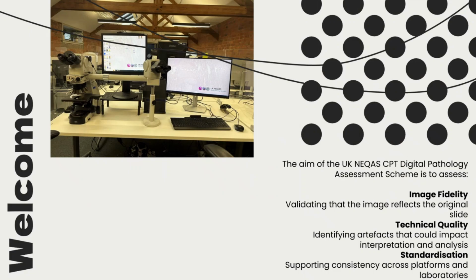The aim of the digital pathology quality assessment scheme is to assess the quality of the digitisation of a glass slide. So if you are familiar with who we are, you know we've assessed glass for years. As it was alluded to when Joe mentioned it, there's been so many glass schemes for so many years. But with the advent of digital pathology, we need to provide a scheme that assesses the quality of how this has been digitised. So we compare the glass and the image.